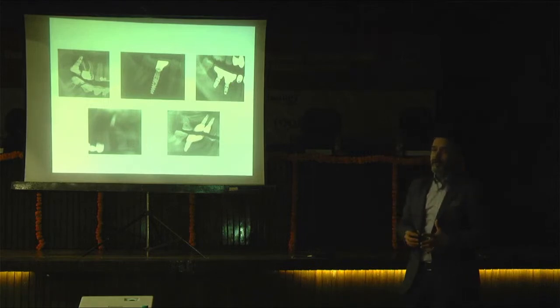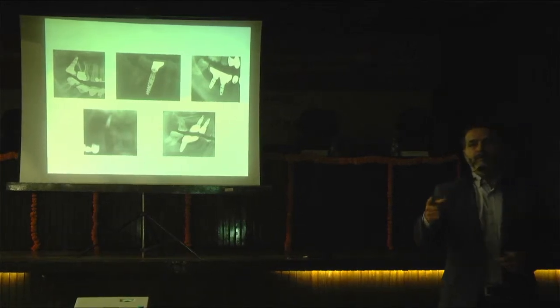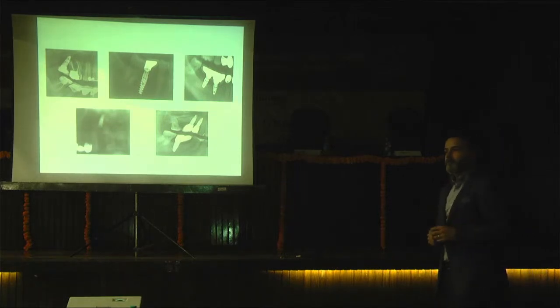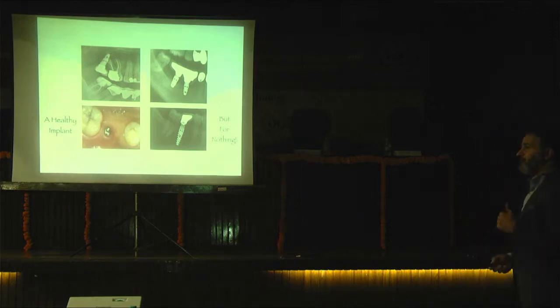I have so many colleagues, good surgeons, and they always tell me, look, doctor, you're going to place only one implant. Do I need to have any guide? Is it very easy? No, it's not about being easy or difficult. And let's try some. We have so many failed cases coming to our clinic. The first one, number 46.